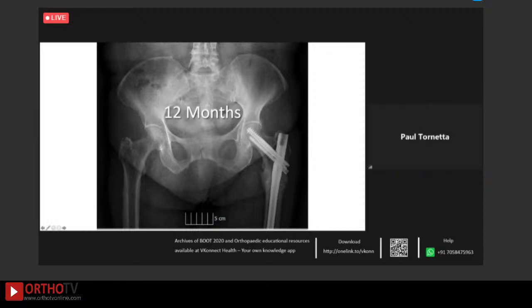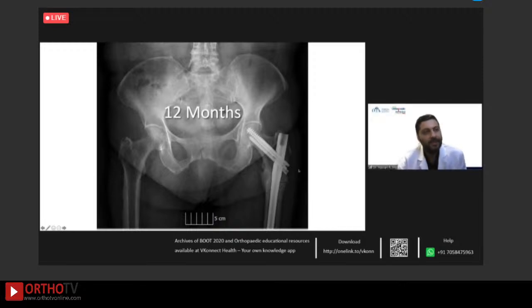I see you did a static lock distally. Why not a dynamic lock distally? That's a big thing that our chairman here, Dr. Sanders, harps on. If I'm worried about not having the fracture clicked in and compressed, I would lock it dynamically. But on her, I was staring at it. It's compressed, and I'm bone grafting it, so I locked it statically.